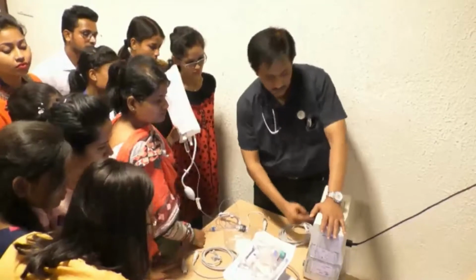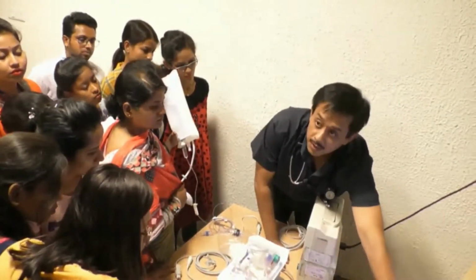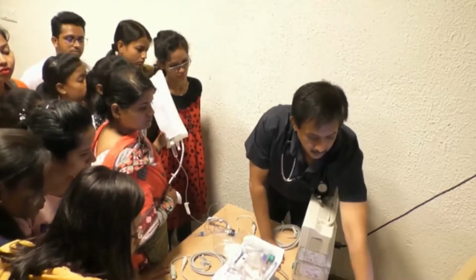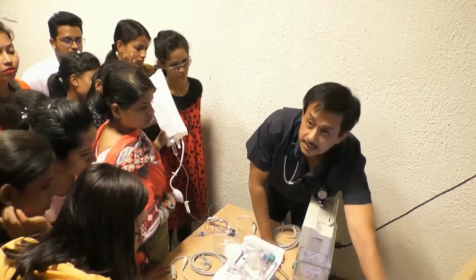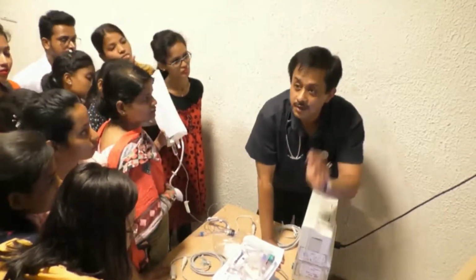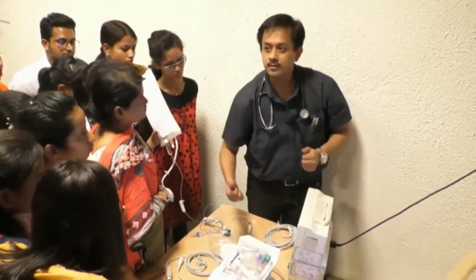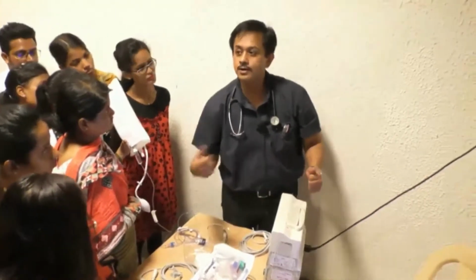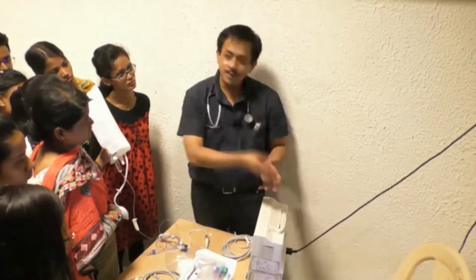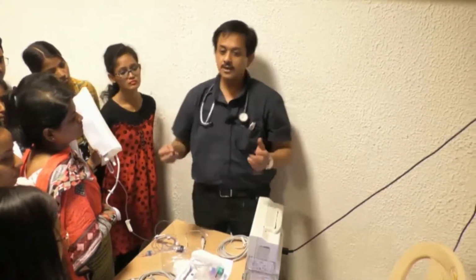Suppose your arterial tracing waveform was this, and now you are getting a waveform like this. This looks like an overdamped graph. That means consider this to be a shock absorber. It's absorbing too much shock, that is, it's absorbing some amount of your pressure also. What are the conditions when it can happen?